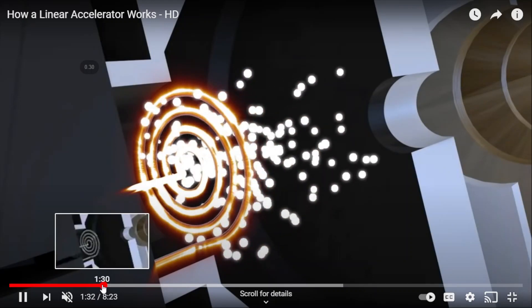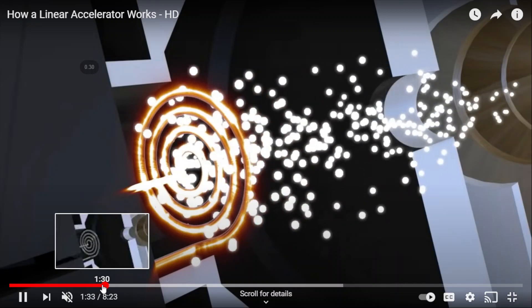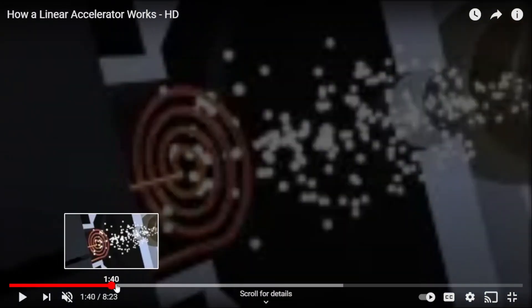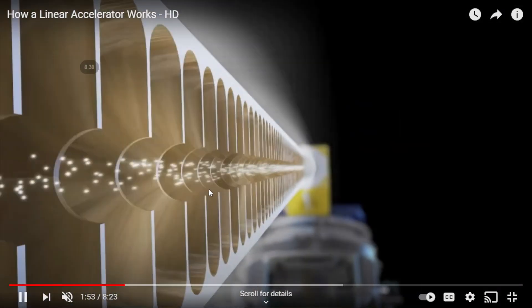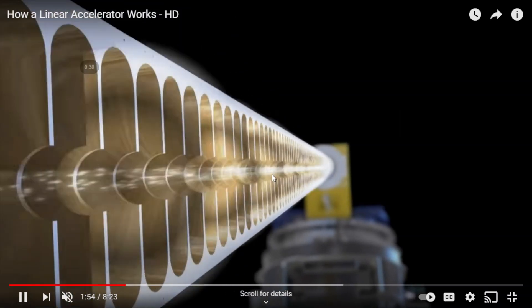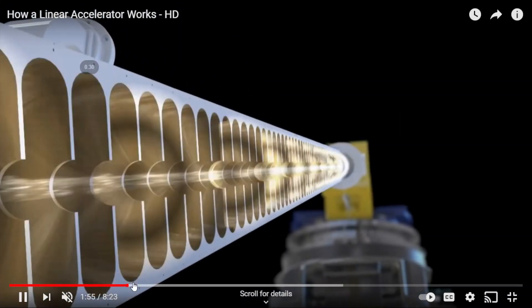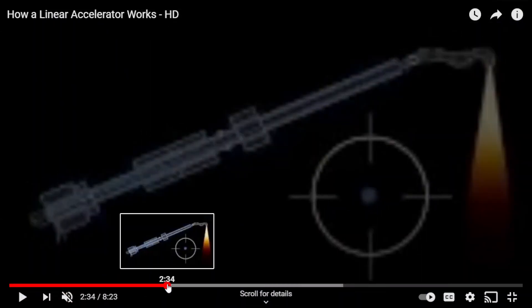Let me fast forward this. You can see the electrons being injected into the accelerator tube. As it goes there, the electrons will be accelerated by the high power microwaves towards the treatment head.